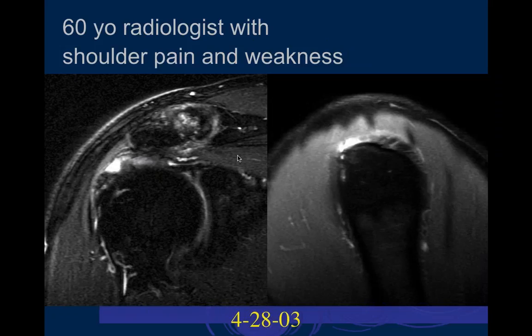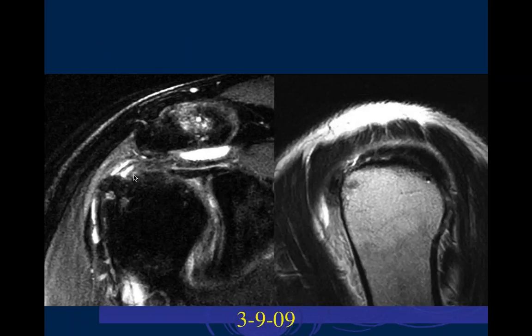But what typically happens at this stage is if you do arthrography, you typically will see fluid going into the subacromial subdeltoid bursa, and this area of degenerative disease that we see associated with the end of the tendon will tend to get brighter on the T1 fat sat images. We don't do pre and post anymore, but back in the days when we did, you would see that the tendon, the degenerative part of the tendon, will take up the contrast and enhance to some extent. Nowadays, we don't do pre-injection imaging, so you would just see some increased signal intensity within the degenerative part of the tendon. Later like this, this is all scar tissue in here as well, scar in situ, and that's variable as to how much it will actually pick up the contrast when you do an arthrogram study.